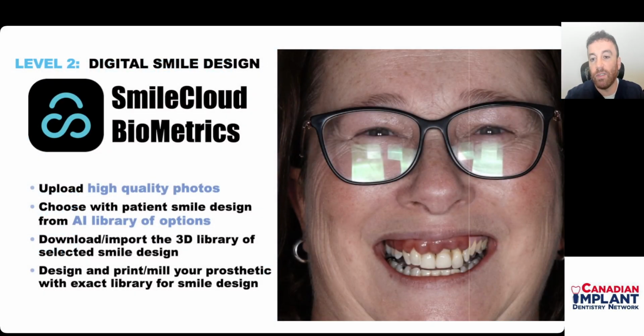Most recently, we've started to use something called Smile Cloud. This is a newer development in process. It allows you to upload high quality photographs of your cases, allows you to choose an AI library of options based on that photo, and based on that smile design, imports a 2D photo into the software, and then you're allowed to export a 3D version of that smile design that can now be used in aesthetic mockups and also smile design in software such as Exocad.